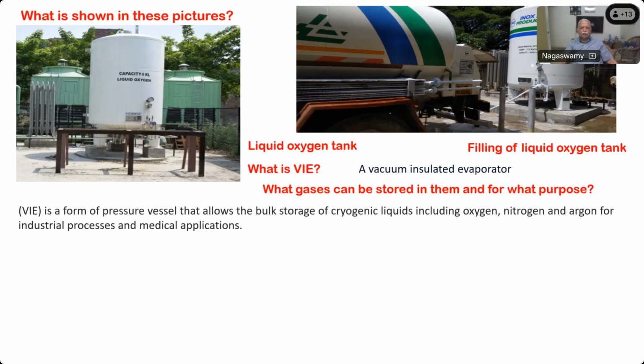So it can not only store oxygen, it can store nitrogen and argon for industrial purposes as well as medical applications. Okay, so don't think that this liquid plant is only for oxygen. It can be for nitrogen and argon also.